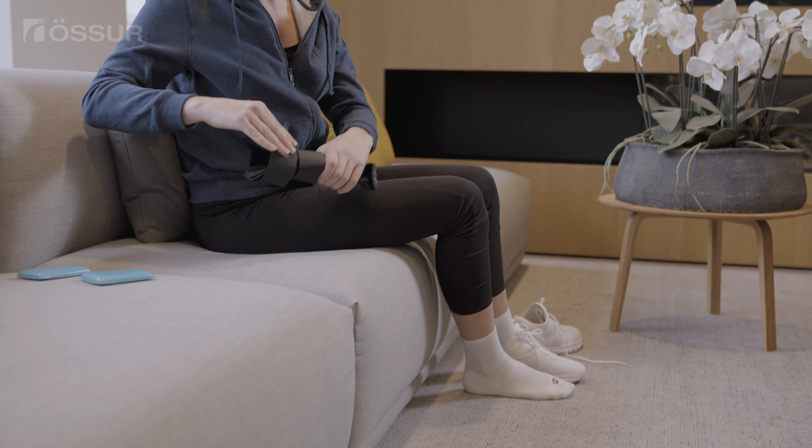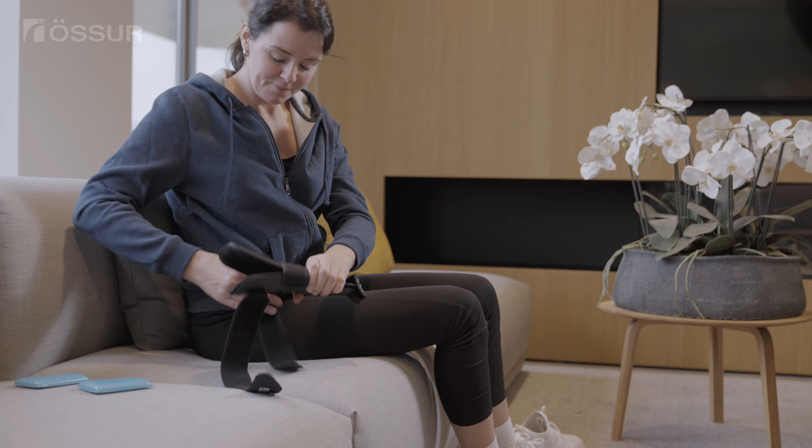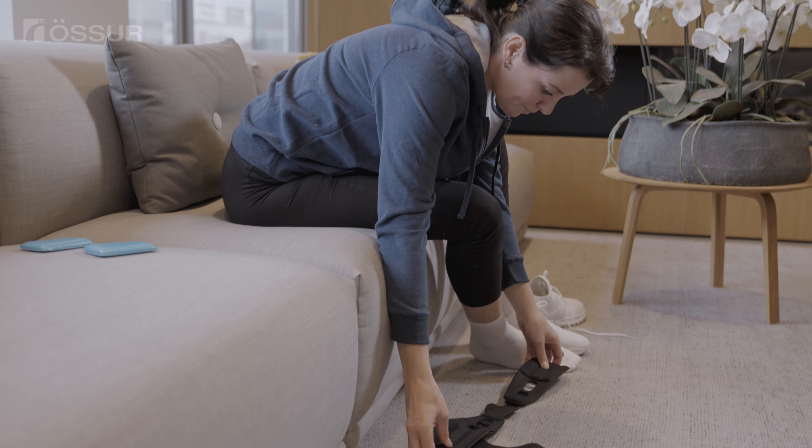In a sitting position, undo the straps. For comfort, always wear a cotton sock underneath the brace. Spread the shells and place the heel on the heel strap to check the fit.